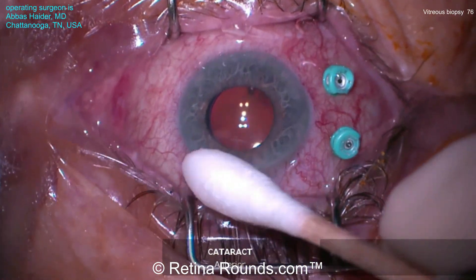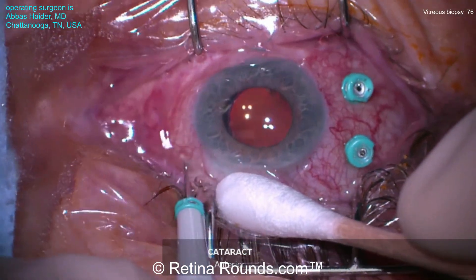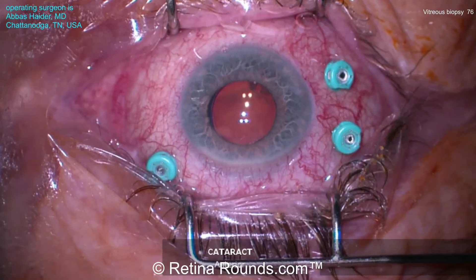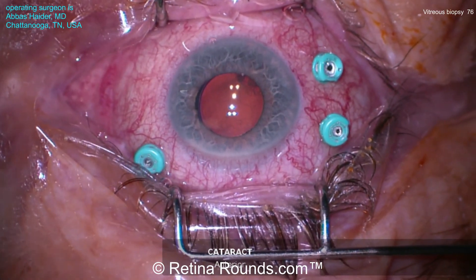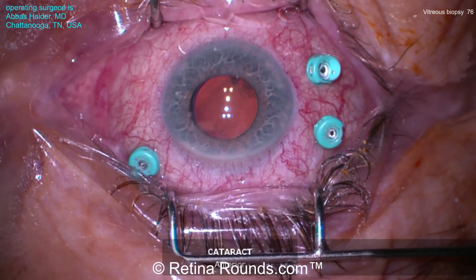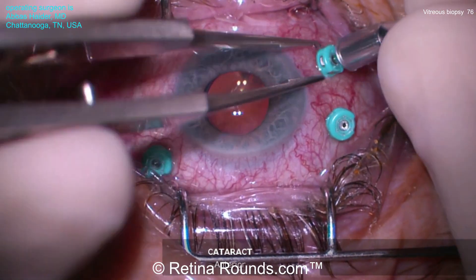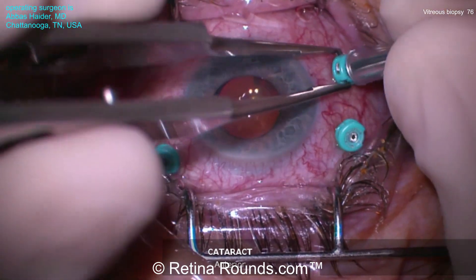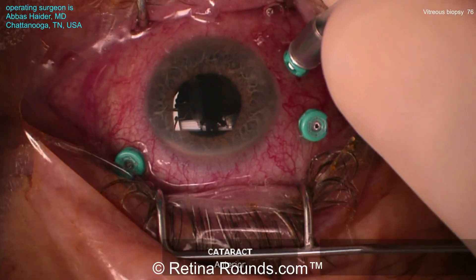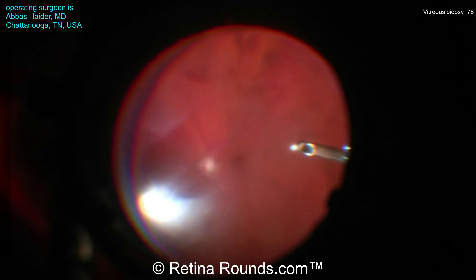Alternatively, air can be infused through the infusion line during the vitrectomy to avoid dilution of the vitreous specimen. With this approach, it is important that the infusion line is infusing air and is clear of balanced salt solution before it is connected to the pars plana trocar. In addition, priming the vitrectomy probe can result in BSS in the aspiration line of the vitrector. One can either skip priming of the vitrectomy probe or aspirate air to clear the aspiration line of BSS.